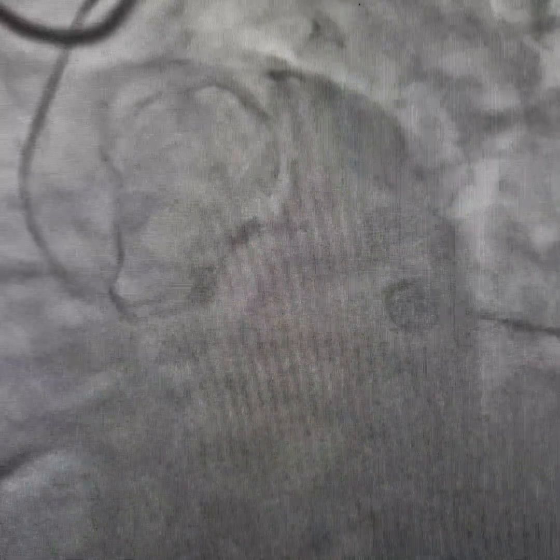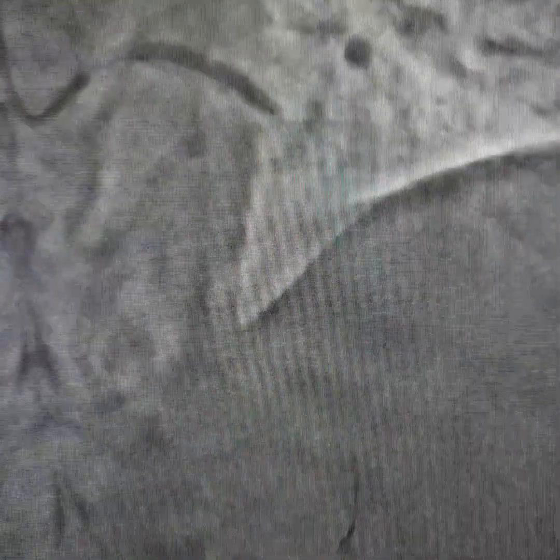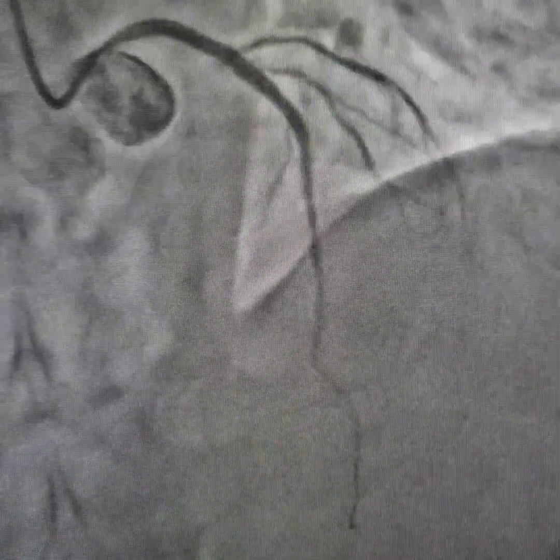We are able to achieve good stent expansion — you can see the 3.5 mm stent expanding very well. Doing post-dilatation with a 3.5 mm balloon, some more stent expansion. We are going up to 16 to 18 atmospheres of pressure.